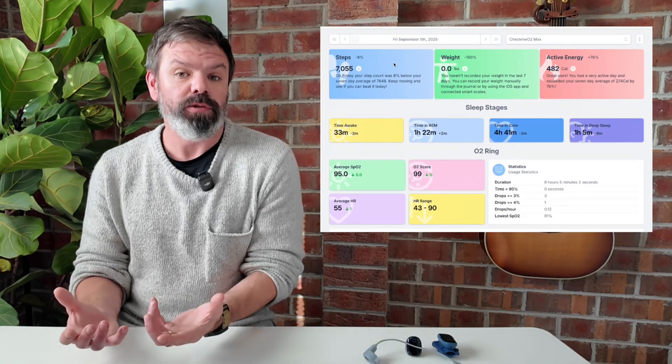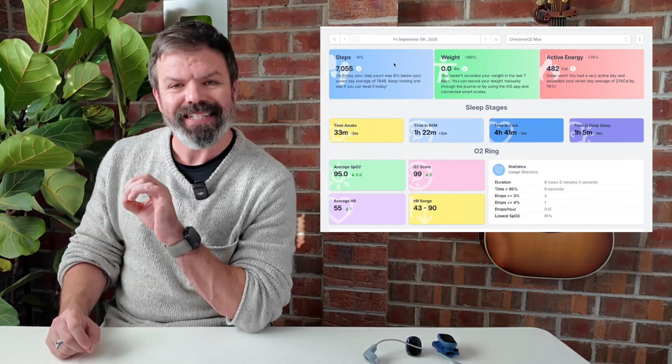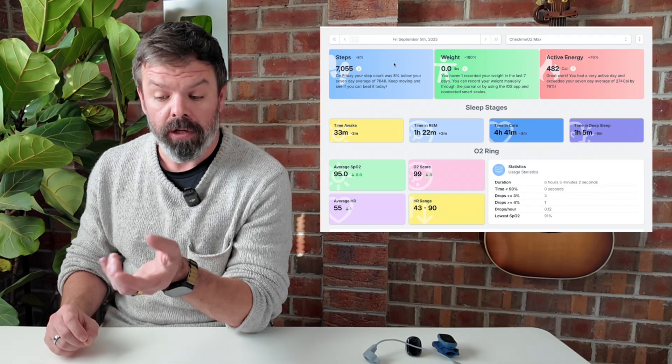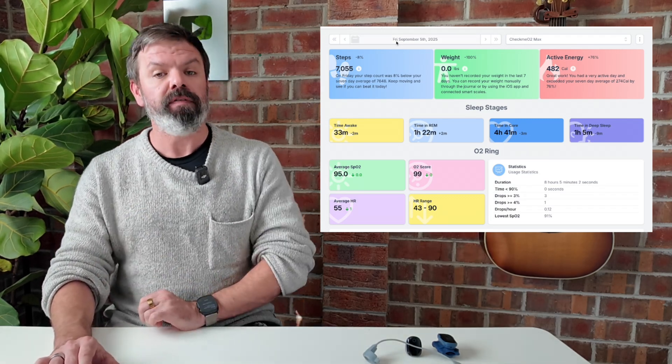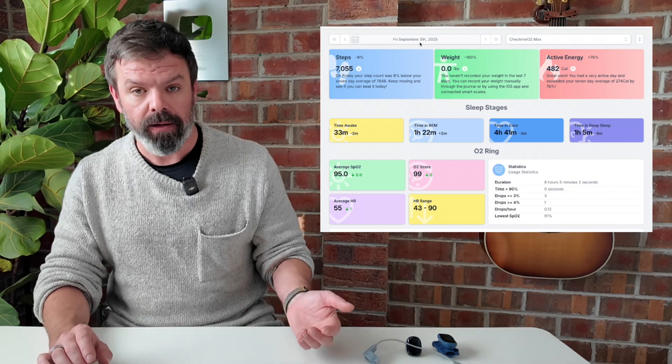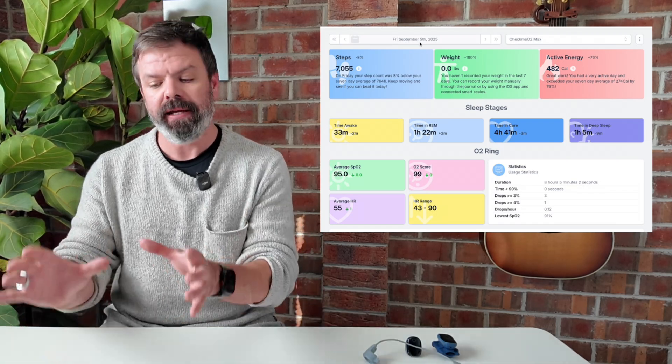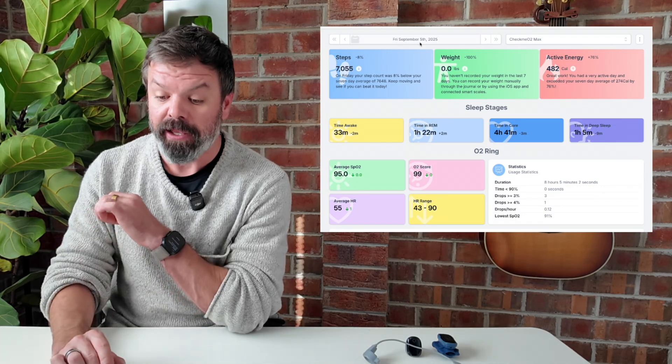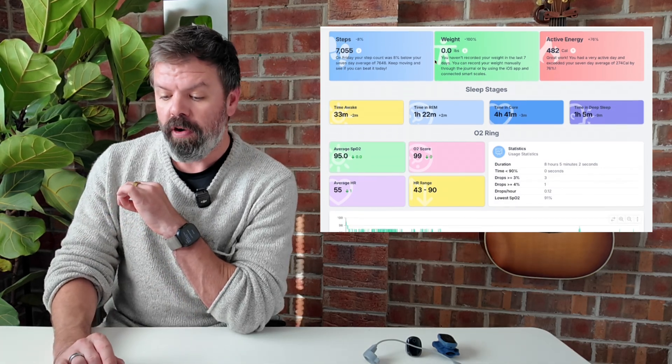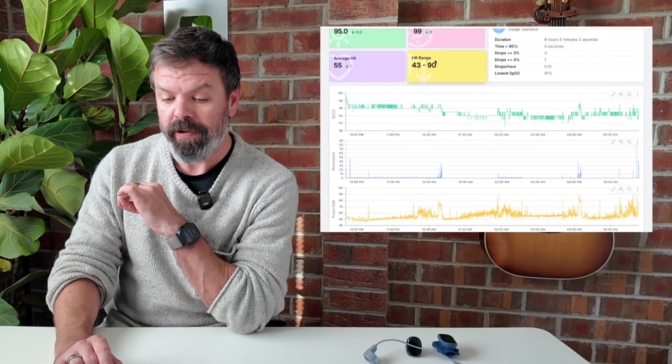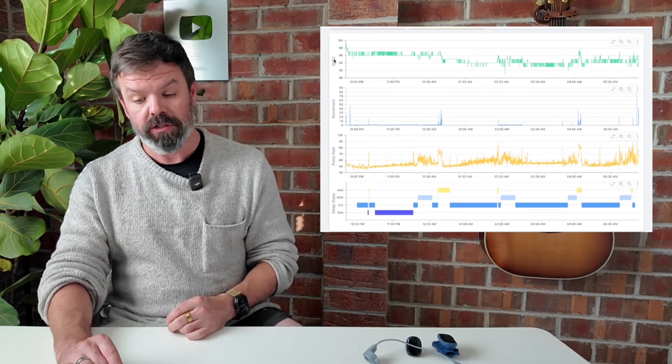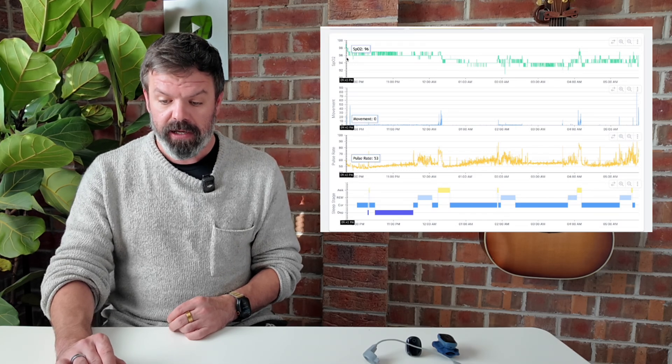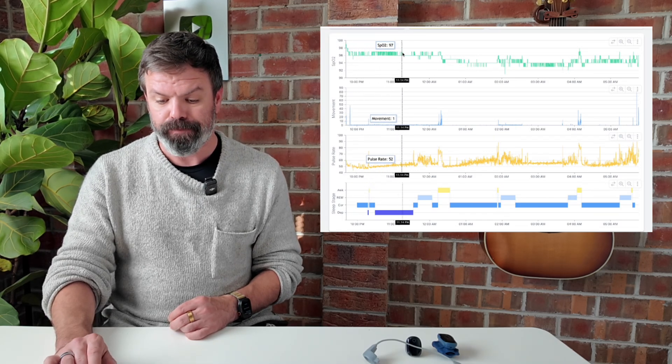And this is what it looks like inside of Sleep HQ. So this is the daily dashboard, the daily view. So we can see here, we're checking out Friday, September 5th, 2025. Go to bed, wear your ring, wake up the next day, and you have all this wonderful information at your disposal. So we'll scroll down here. We've got all the statistics, your O2 score. We've got the high resolution traces here. SPO2, this is your blood oxygen levels. So we can see what the blood oxygen level is doing throughout the night.